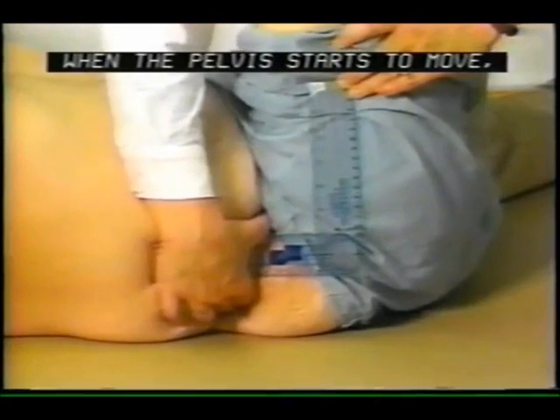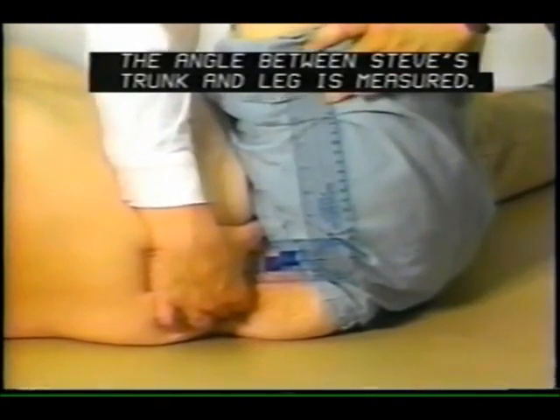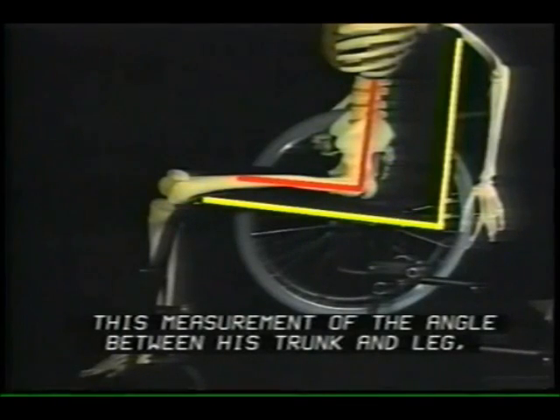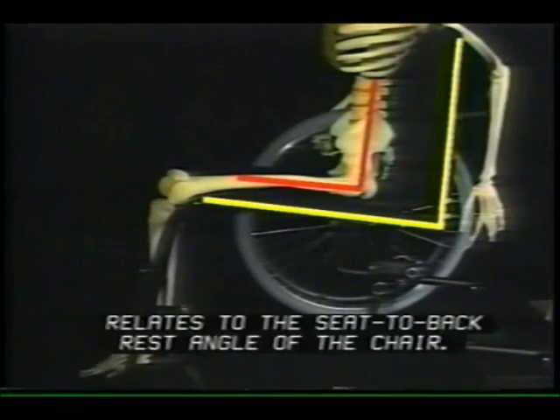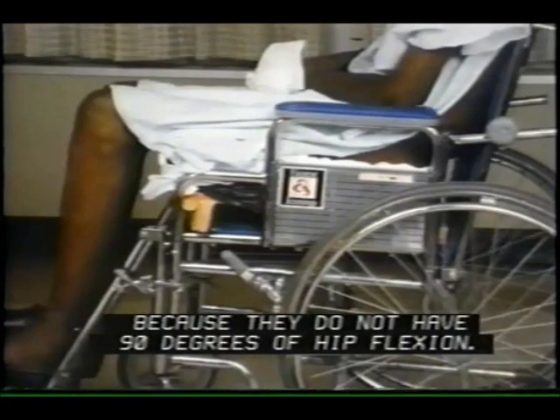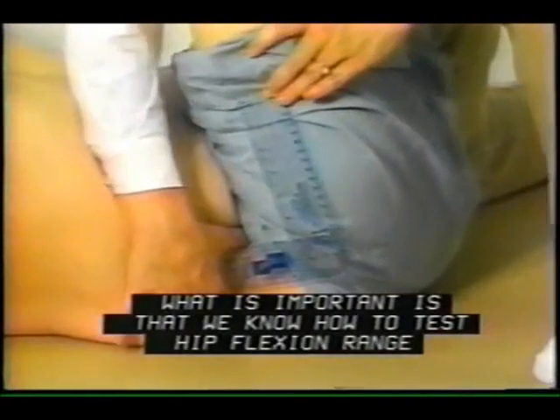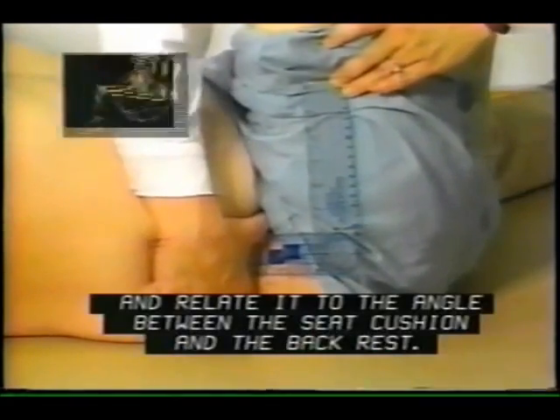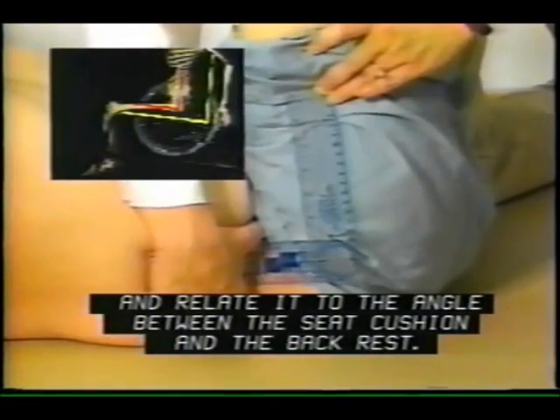When the pelvis starts to move, the angle between Steve's trunk and leg is measured. This measurement of the angle between his trunk and leg relates to the seat to backrest angle of the chair. Not everyone can sit in a wheelchair that has a 90-degree seat to back angle, because they do not have 90 degrees of hip flexion. What is important is that we know how to test hip flexion range and relate it to the angle between the seat cushion and the backrest.